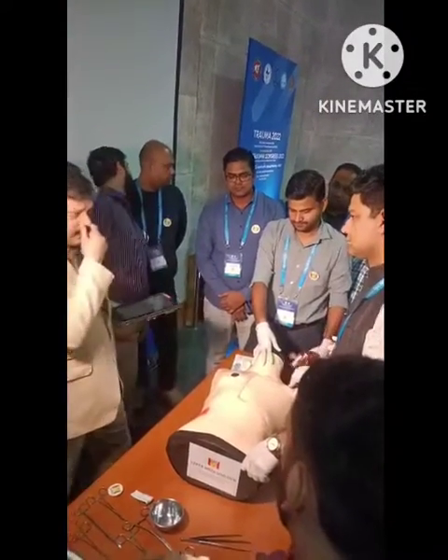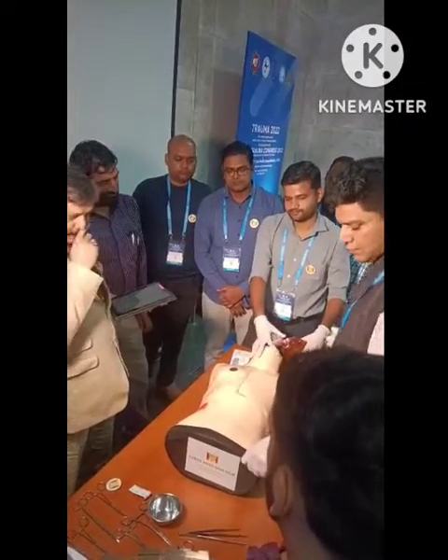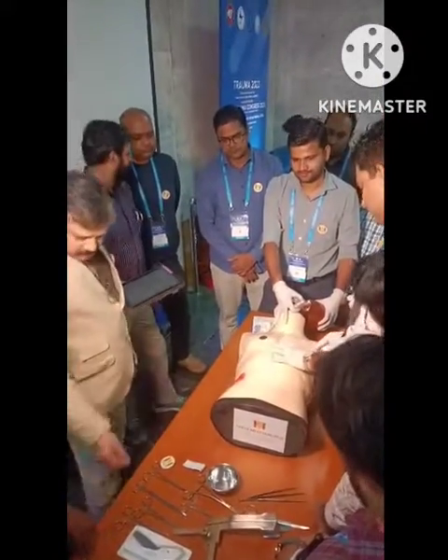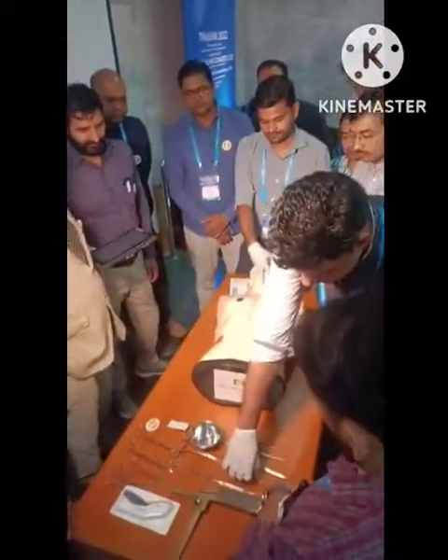Okay, so as of now he is doing BVM. No, he is intubated. Okay, then what next? Okay, I will do resuscitative thoracotomy. No, scalpel, and be safe, है ना? Which scalpel will you use? For skin.